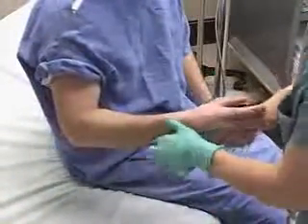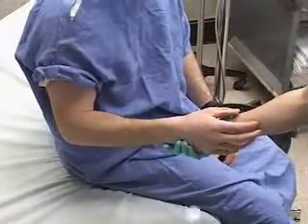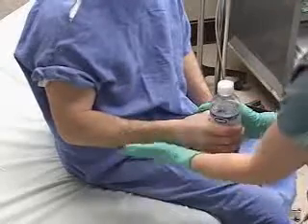The patient's arm is in neutral position, 90 degrees at the elbow. You can have the patient hold or pretend to hold a drink container to achieve the neutral wrist position.